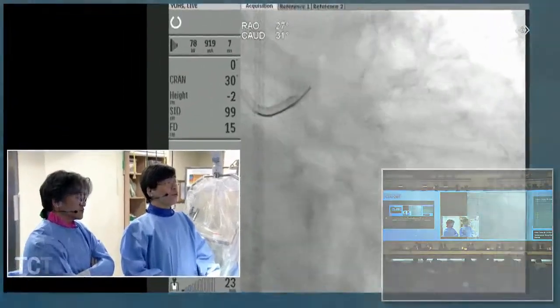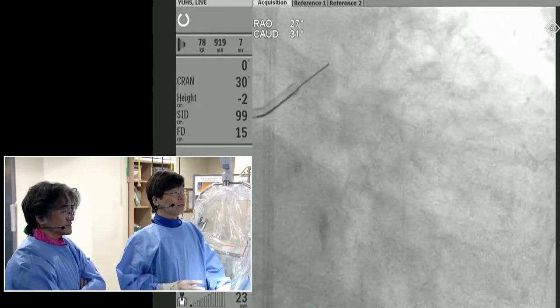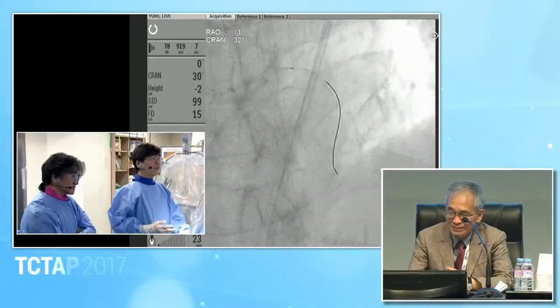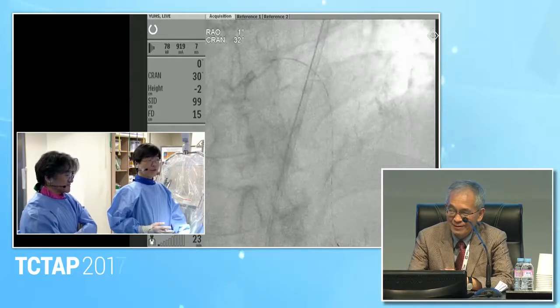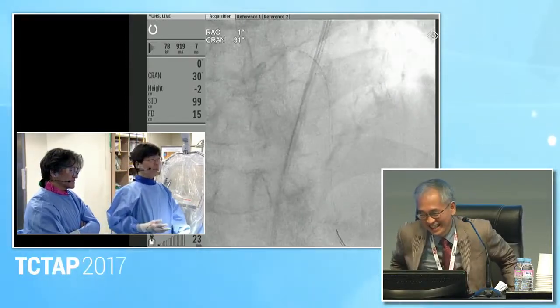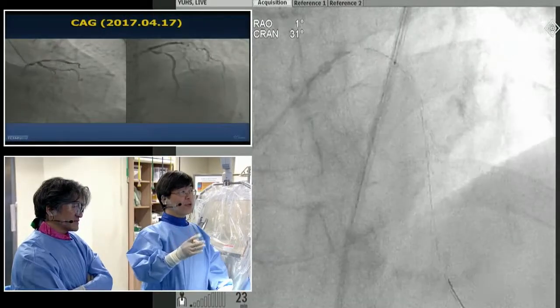And then we introduce a wire without any contrast dye guidance. Next. You are using the calcium line for wiring. That is one of the indicators. And then change the direction and advance the wire. So far, no contrast. Yes, of course. Next, that is the LAD. And then we will do the IVUS examination for the lesion location and other information. Professor Kim will provide the IVUS information. Next.